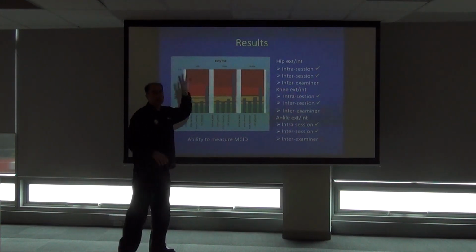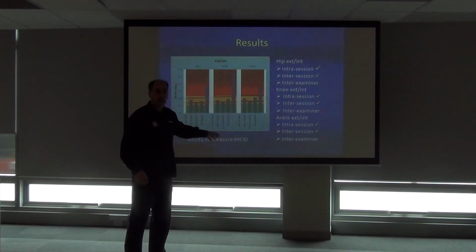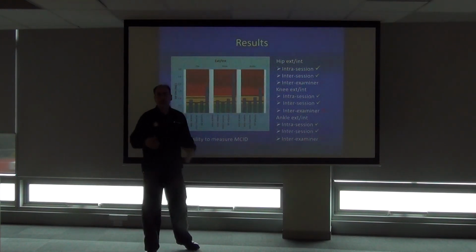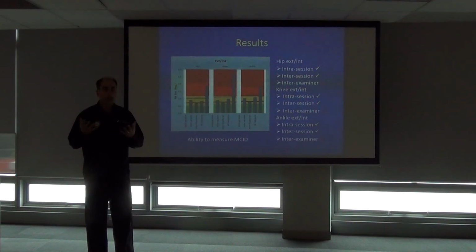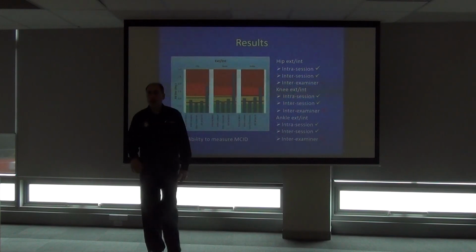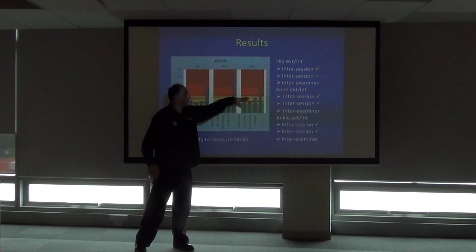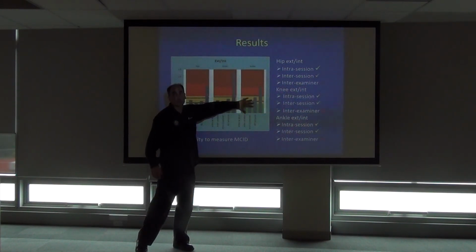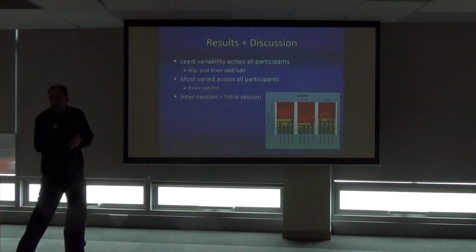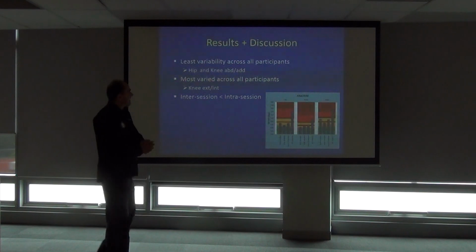So previously, it does affect moments. You cannot ignore bad rotation angles and say, oh, my moments will be okay. They won't. Then at this level, we're talking subtle differences in alignment to get from here to here. I don't know, a degree or two, but maybe it won't have a great effect for moments. Maybe if you're down in this area, that's fine for moments. Okay, we'll keep moving.